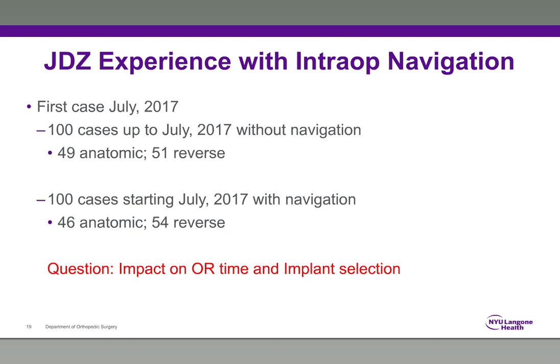So let me tell you about my experience with intraoperative navigation. I started using this technique in July of 2017, so it's just about 2 years ago. We analyzed the 100 cases I did up to July 2017, and compared it with the first 100 cases I did after July 2017 using navigation. You can see the split between anatomic and reverse is about the same, about 50-50, a little more reverse in the second group of 100.